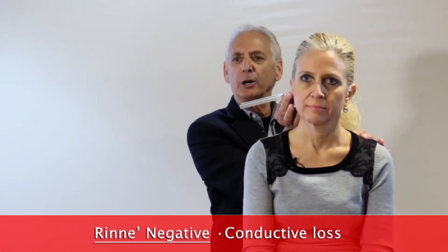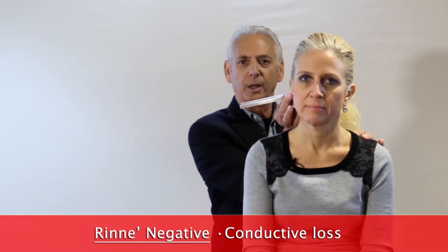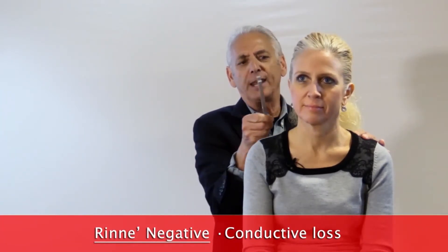When they no longer hear it by bone conduction, I'm going to hold it to the aperture. And if they don't hear it — because we're always going to hear longer and better by air conduction than we do by bone conduction.